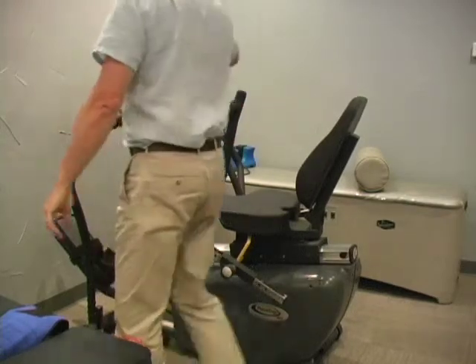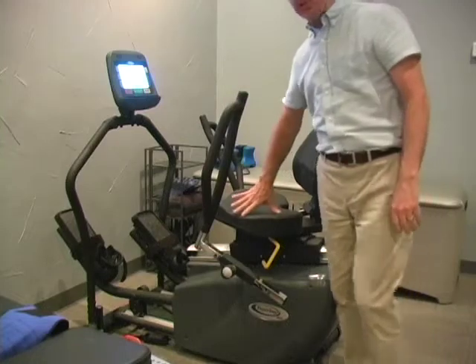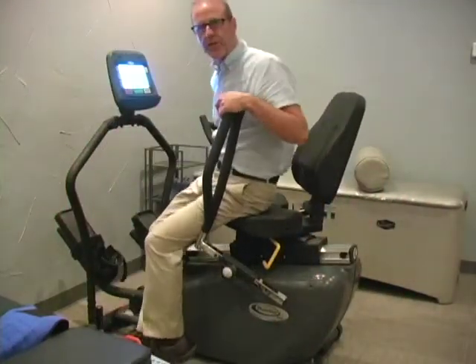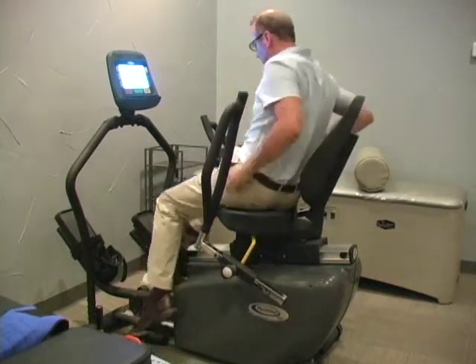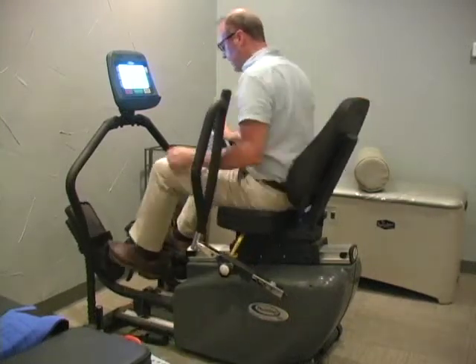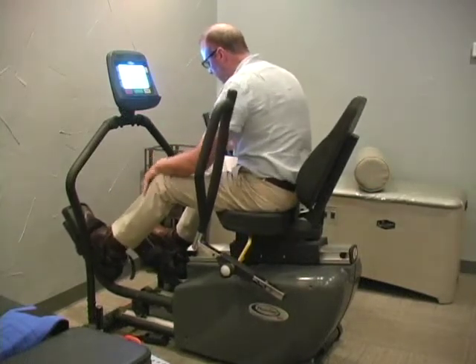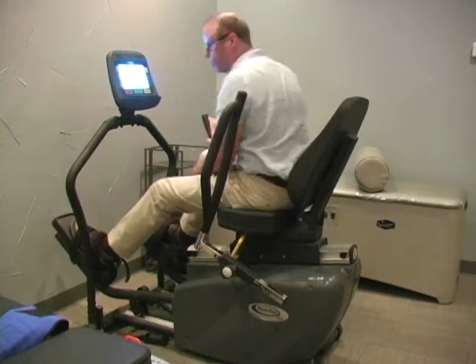The way you get in — you can get on either side. The seat will tilt and rotate out. Have the patient get in, then straighten the seat. Place the feet in the footrest and velcro on top of the foot to secure the feet.